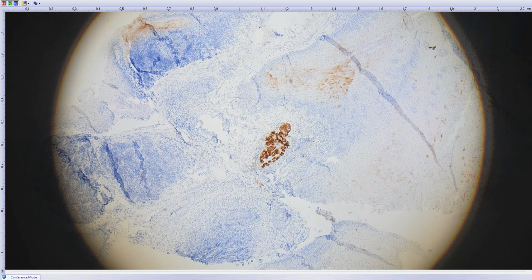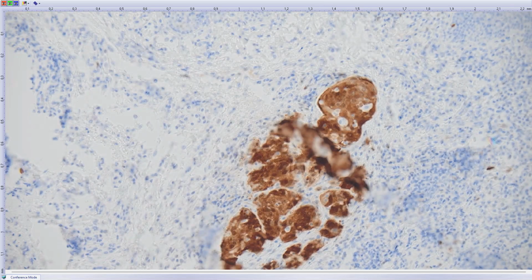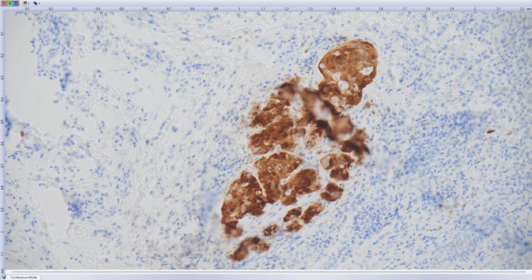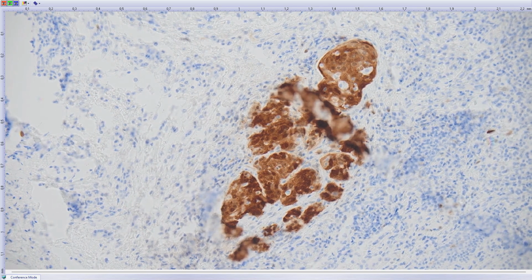Here and here you've got this very minute discrete infiltration of this P16 HPV associated oropharyngeal carcinoma. And as Michal said, there is no category of in situ lesion for this. All of these tumors, even when looking like something in situ, should be considered already invasive.